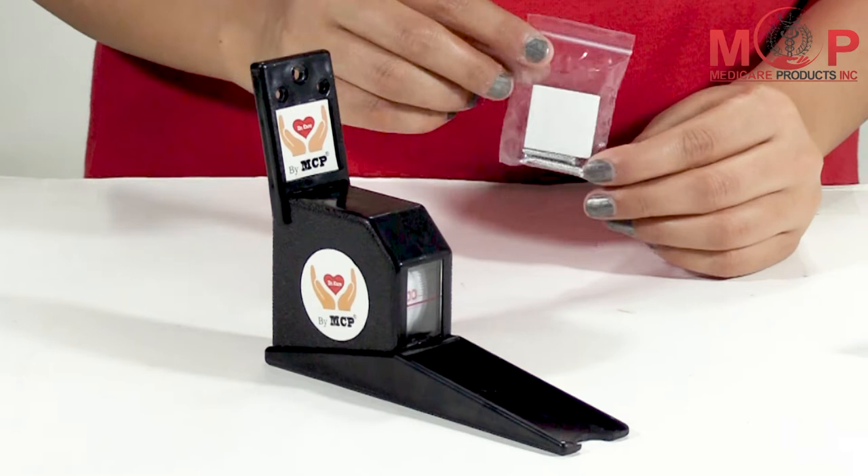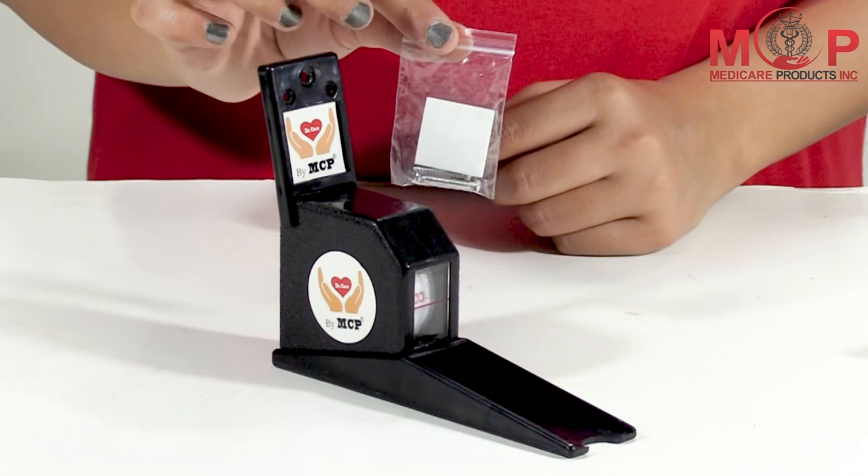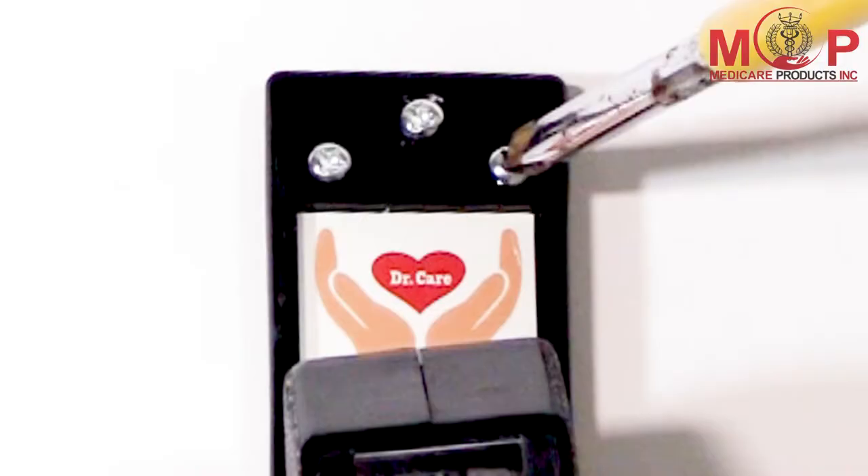The box comes with one unit stature meter tape and a packet containing double-sided tape and a screw.